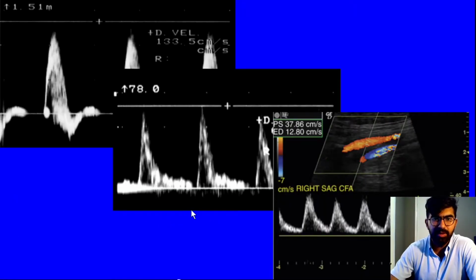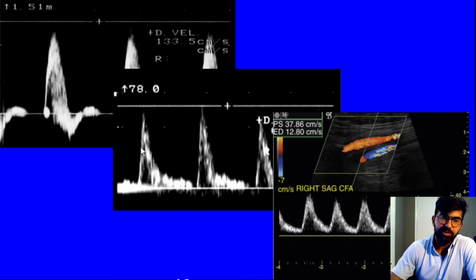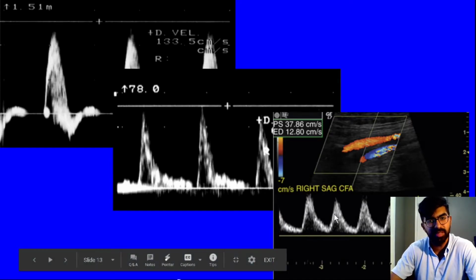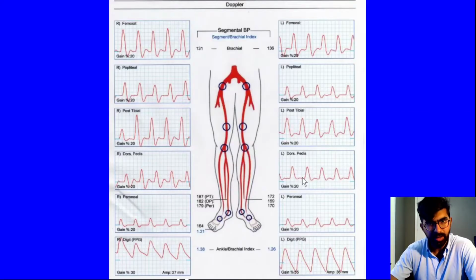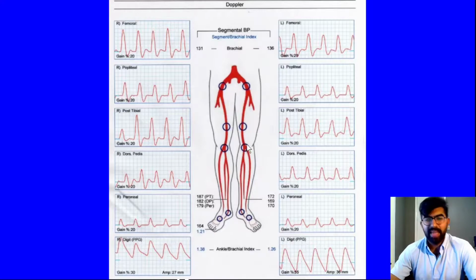And you can see an example of this. Again, the waveform you mentioned before. You have the patient with the distal disease, and then you have the waveform with inflow stenosis. Now, in this representation, the upstroke does look sharp and rapid, but these are in two different scales, and this is why it's so important to look at the scaling, and you see the peak systolic velocity is really only about 37.